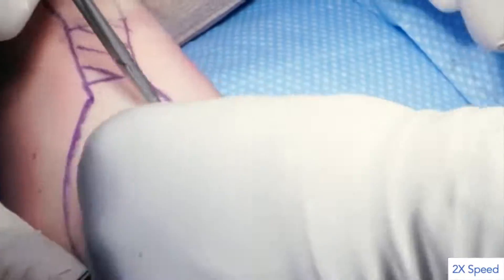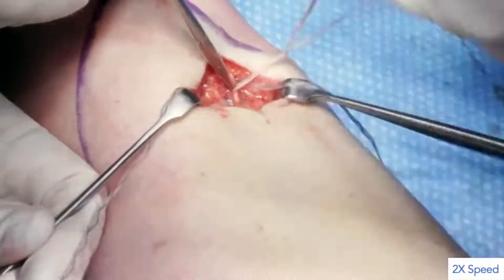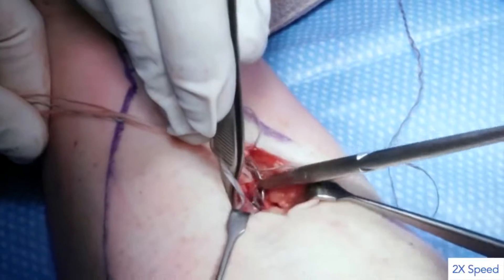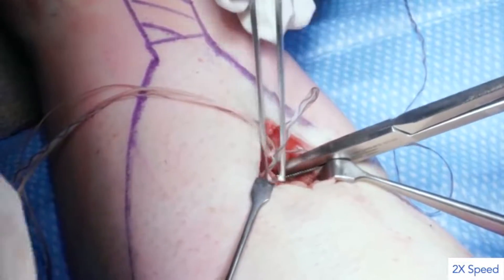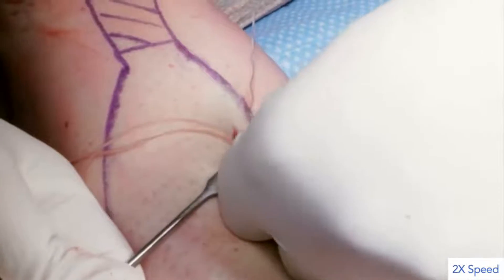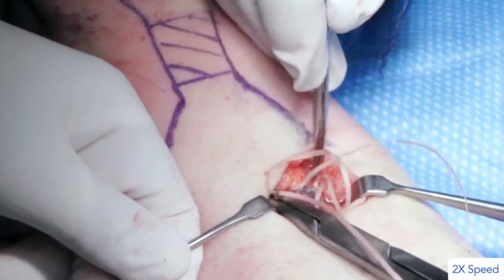A needle driver is used to hold the first tie under tension, with several hand ties subsequently performed. One end of suture number 2 is loaded onto the free curved needle and passed through the aponeurosis using the Krakow technique. The knot tying process used with suture number 1 is then repeated with suture number 2. One end of each suture is trimmed with scissors at the knot, while the remaining end is used with the curved needle to bury each knot into the tendon.